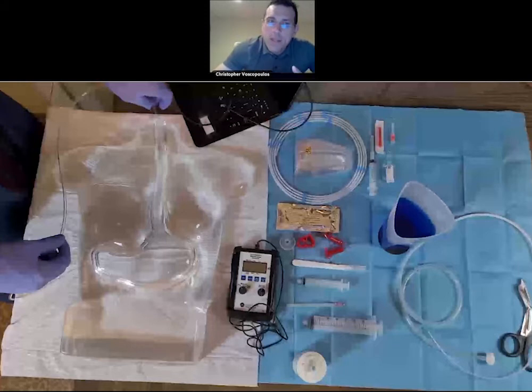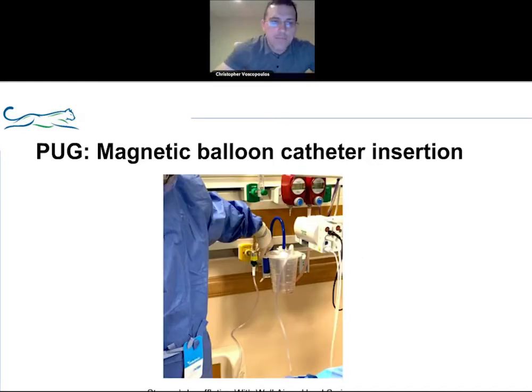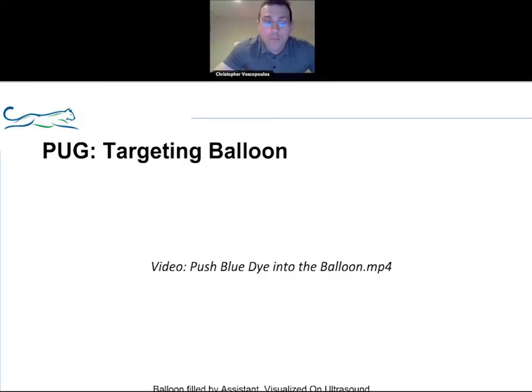Why I wanted to present this is that for those of us who have watched our gastroenterology colleagues do an EGD approach, you would be familiar that there has to be insufflation. We use approximately 250 cc's of air because we want to fill the stomach to allow it to come up to the anterior portion of the body, closer to the skin. Since we're not doing an EGD approach, what is left in the patient is a nasogastric tube, and we can insufflate the stomach with that nasogastric tube. You can either do it directly from the wall, or you can simply use a hand syringe.